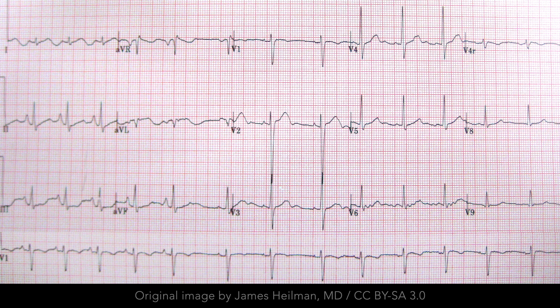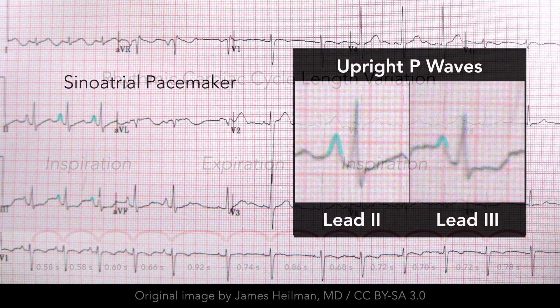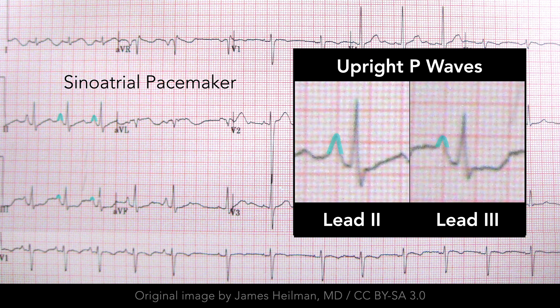Respiratory sinus arrhythmia is a benign phenomenon in which the PP interval varies with respiration. The rhythm is regularly irregular — the heart rate increases during inspiration and decreases during expiration. The variation between the shortest and longest cardiac cycle length, that is the PP intervals, is greater than 10%, or 120 milliseconds. The heart rate is between 60 and 100 beats per minute, although it may momentarily extend beyond these limits. It is important to note that this is in fact sinus rhythm — every QRS complex is preceded by a P wave with constant morphology and upright in leads 2 and 3, and the PR intervals are also constant.